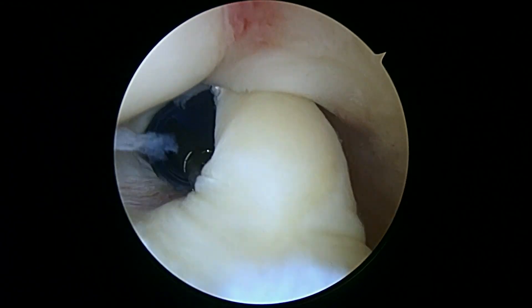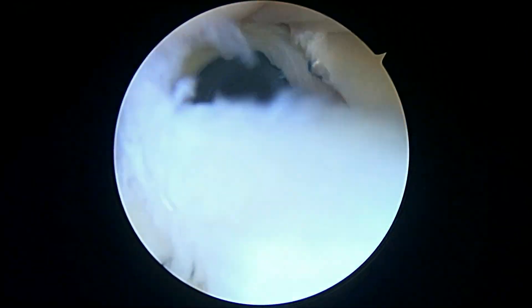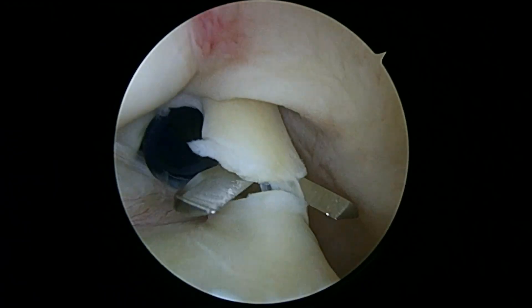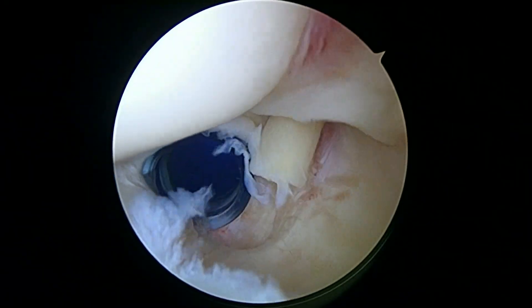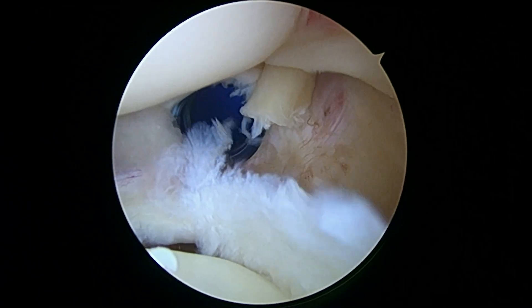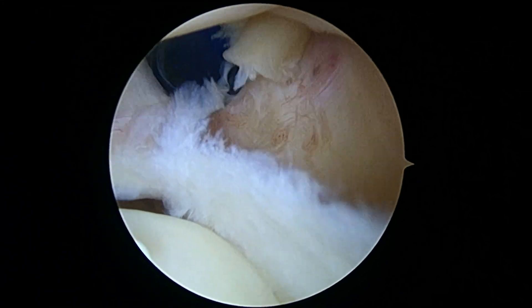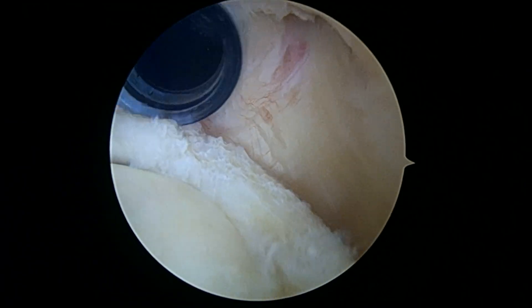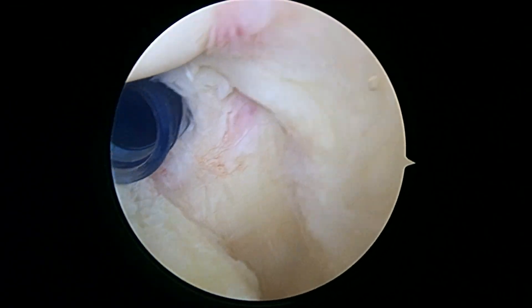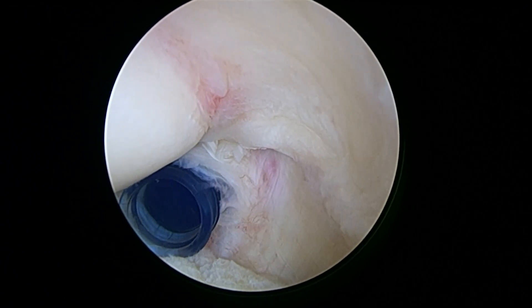Now the biceps is released and we still have that suture holding it — we're still able to control it. Now we're going to clean up the rest of the labrum because you can see how frayed that is. We've trimmed back the labrum — that looks 100% better to me. Nothing loose. Rotator cuff on this articular side at the top of the screen — that's your supraspinatus tendon — and that looks great.